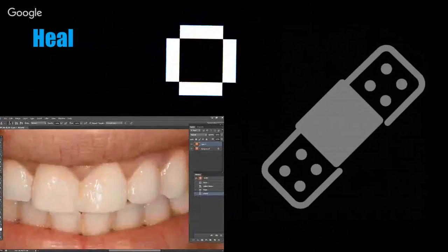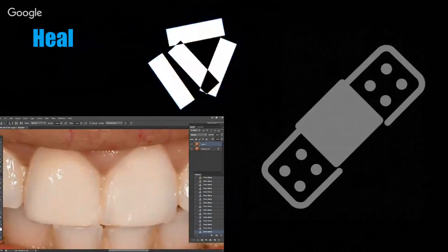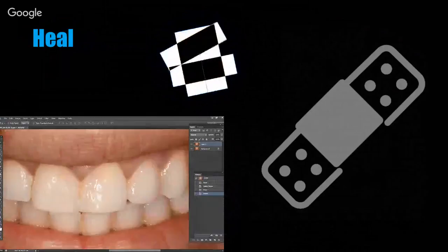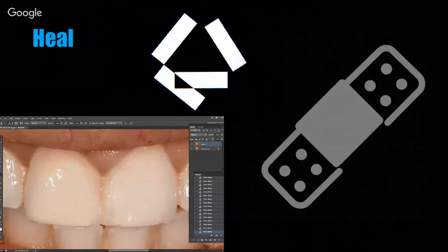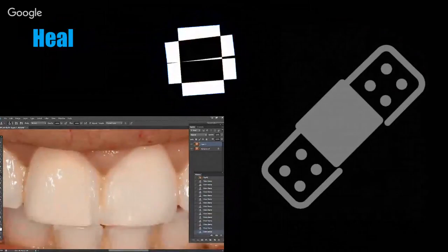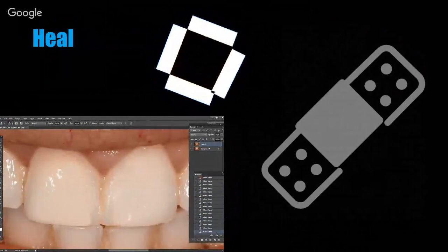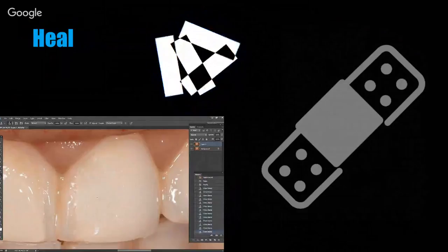You know, you go to a photography studio, all of them will be using Photoshop right there. After you take your picture, you get out, you feel like you have makeup on. It's like that photographer has just applied makeup on your face. So this makeup is usually because of this healing tool, because it mixes neighboring pixels together in the picture. It's a really powerful tool to hide certain problems in the teeth. And it's really effective when used in conjunction with the previous tools.